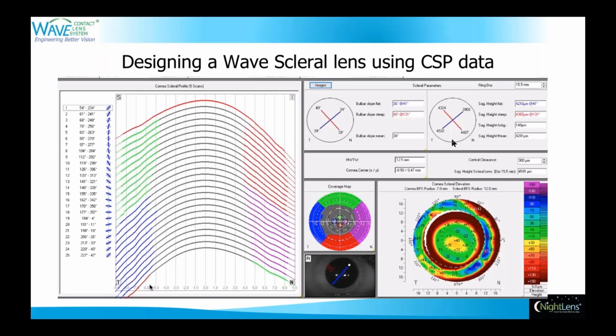And now we have a much better understanding of how, in a situation like that, that scleral lens is just pressing on the goblet cells and producing that mucin that climbs down the back surface of the contact lens come later in the day. And this helps me decide right from the get-go, do I leave this patient in their rotationally symmetrical scleral lens I've had them in for years, or do I need to jump to something like the WAVE or something more advanced like impression technology? I shouldn't say advanced, something more complex when they have such a great asymmetry.